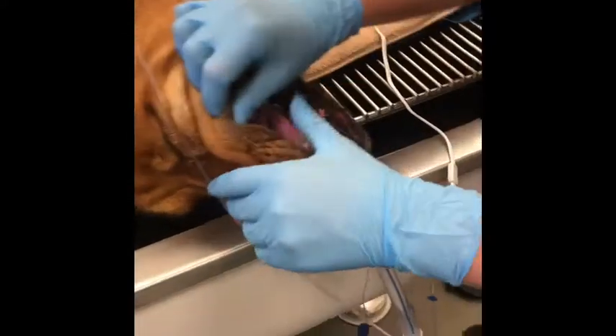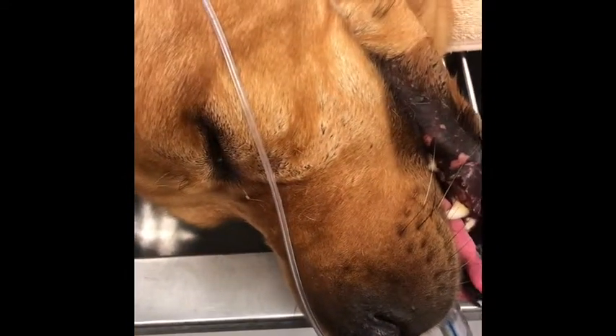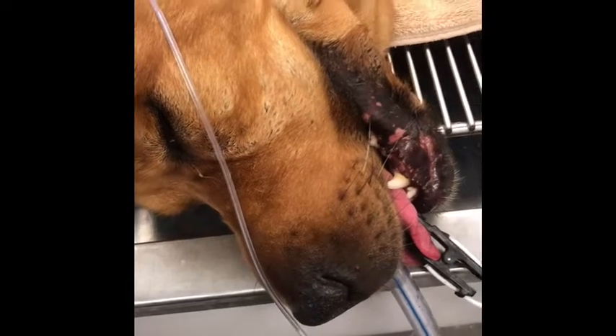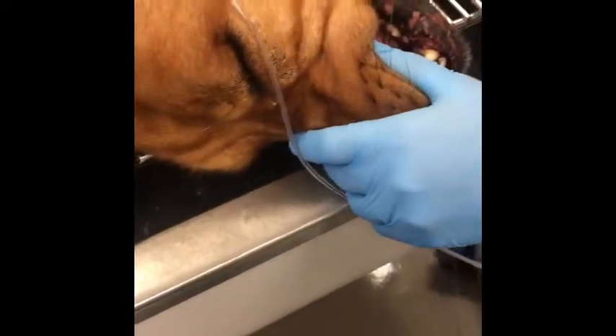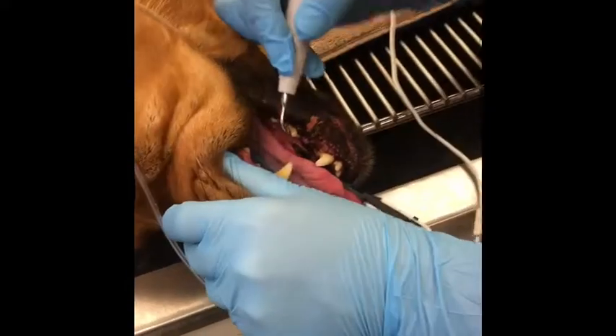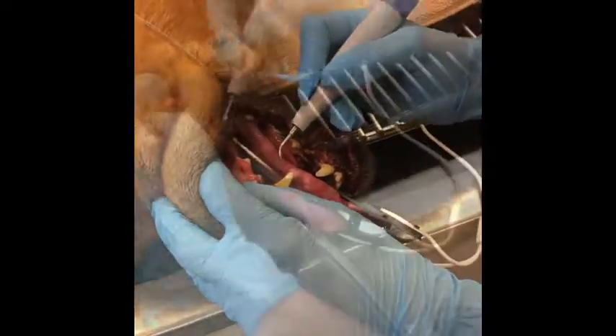We're actually going to go ahead and use our ultrasonic scaler to get some of this off. The most important part, of course, is not to stay on the same place of the tooth or the same tooth for more than 10 seconds. We also don't want to destroy the gingiva itself with the scaler.